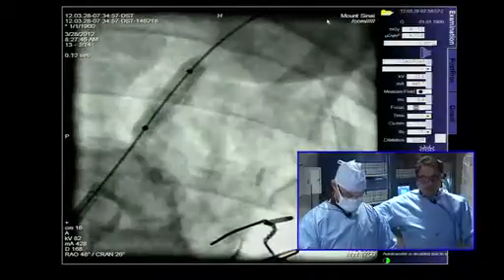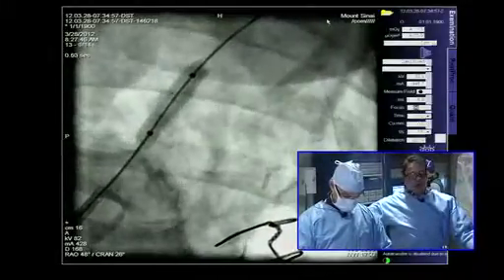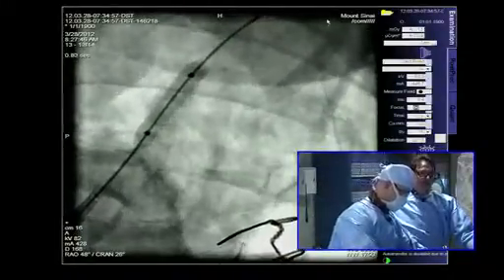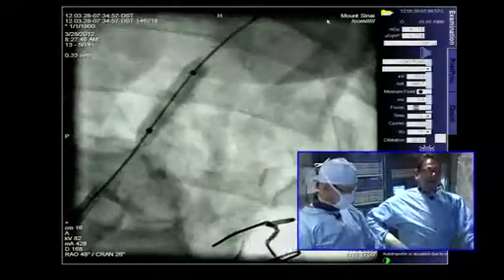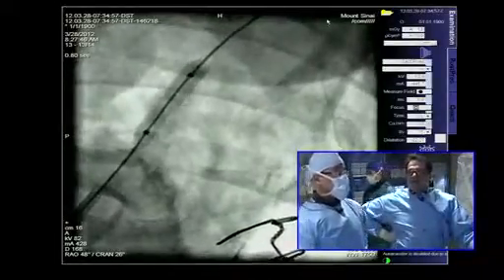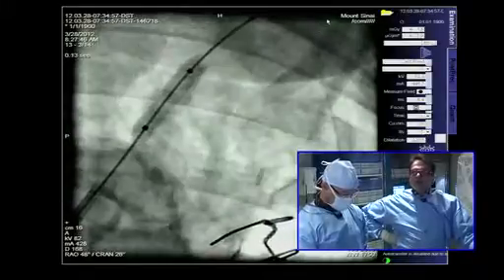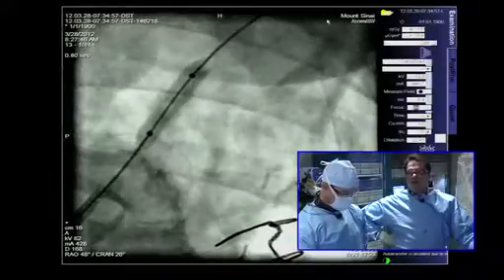Well, you're absolutely right, distal embolization is a problem with everything that we do, as you know very well. And I think the reason to put a filter in a vertebral hasn't really been defined. There are people who do it, and in our experience, vertebral filter placement has been associated with a lot of spasm. Now, having said that, you could get a brachial access or radial access and put the filter in if this was the only vertebral that was supplying the brain. You could use a percutaneous filter or any sort of softer balloon occluding filter in there, or you could use a regular filter wire up from the brachial access.